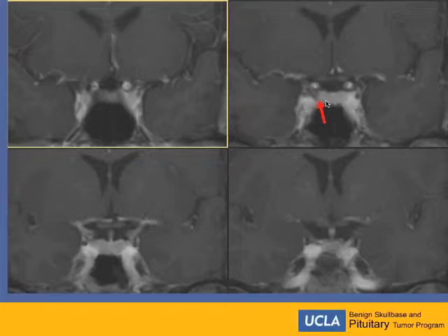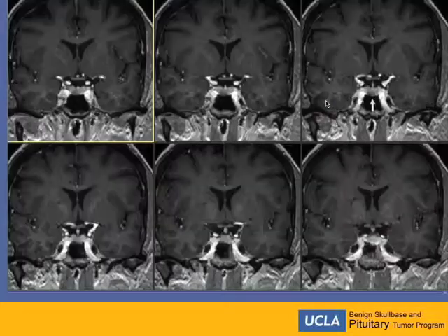As you can see, this hypo-enhancing component is not a micro thing — it's more than two millimeters. But the issue is people don't suspect this as a pituitary lesion because it's so lateralized. They may think this is part of an artifact from the cavernous sinus. In those cases, you really have to have a precise anatomical validation by looking at the different planes.